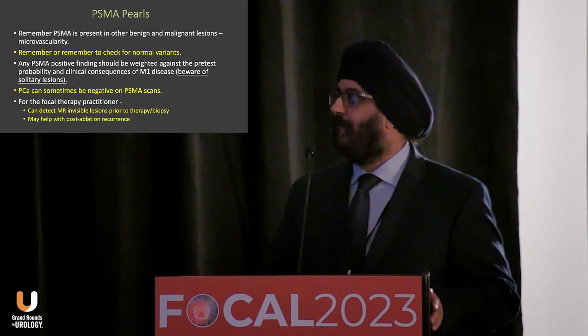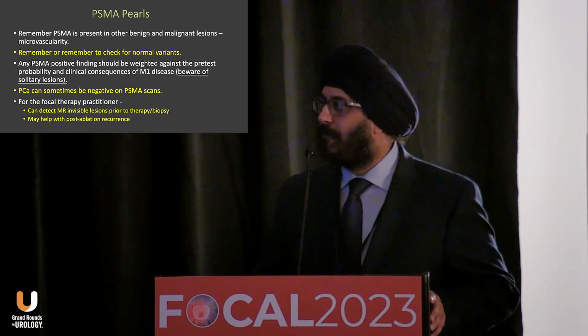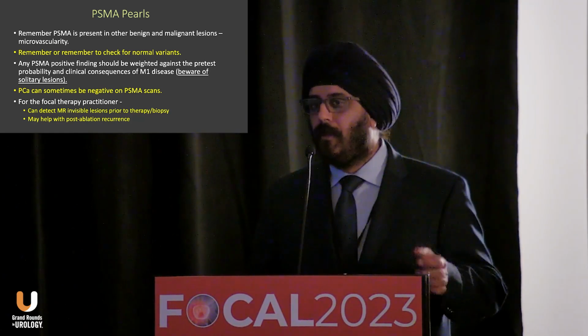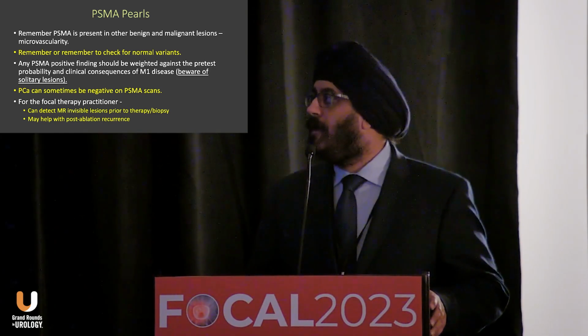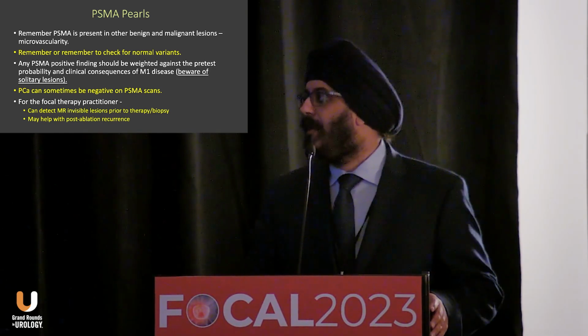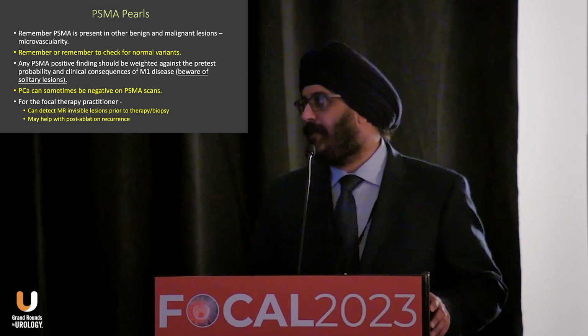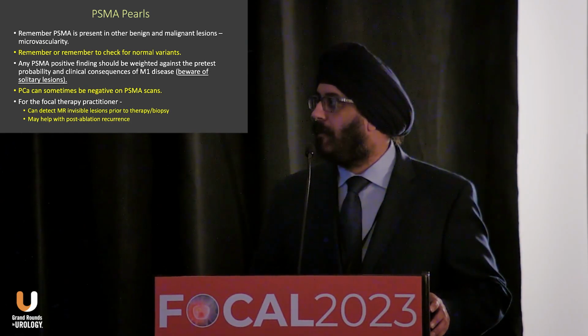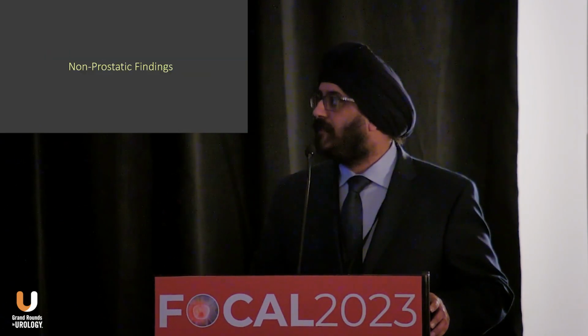Any PSMA positive finding should be weighed against the pretest probability and the clinical consequences of M1 disease, which is very severe. Prostate cancer can be negative on PSMA scans, and for the focal therapy practitioner, it can detect MR invisible lesions and can help with post-ablation recurrence.